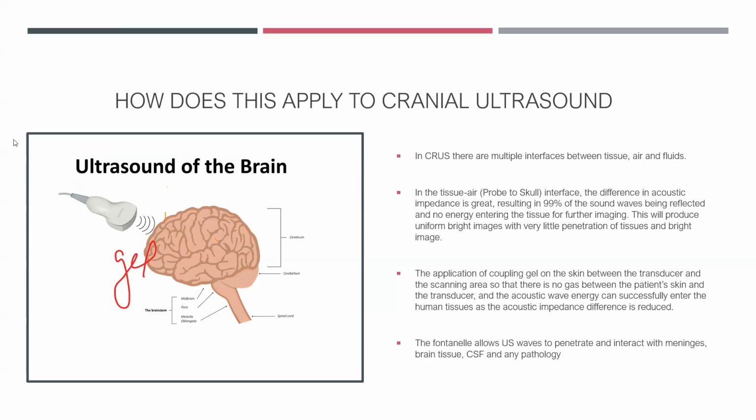That tissue, from your perspective, will be a good reflector. That's why sulcal gyral appearance gives you good reflection and helps you delineate the maturity of the system. And then you have the ventricular system, the margins of which will be good reflectors because of the difference in acoustic impedance. But in the fluid-filled areas of the brain, it's all fluid, so the propagation velocity will be the same.